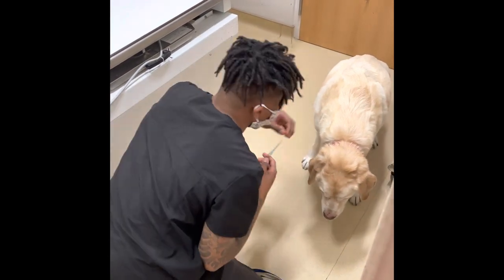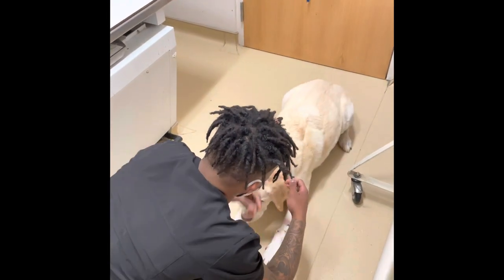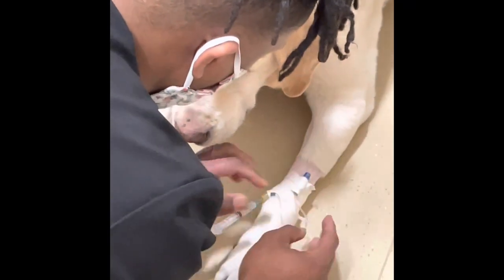This handsome fellow right here is having some upper respiratory issues, so the doctor wants to take a look inside to see what's going on. Since he already has an IV catheter, I'm just going to give him the drugs that way.